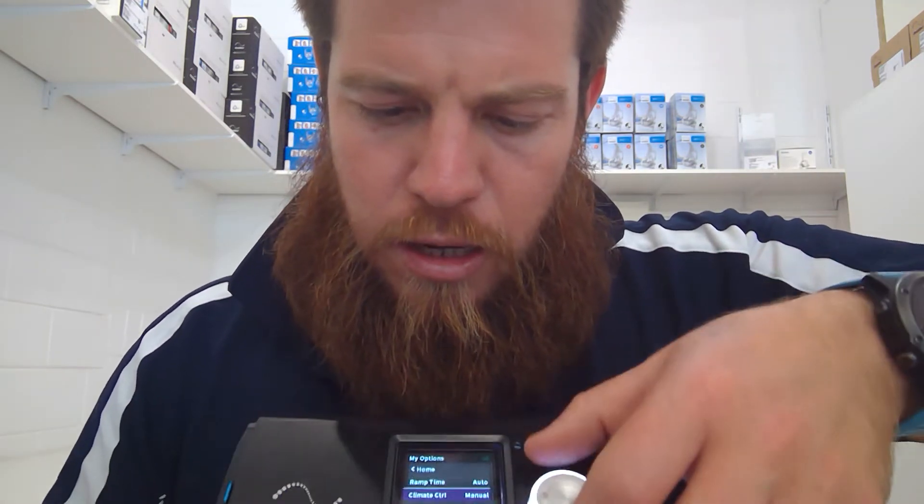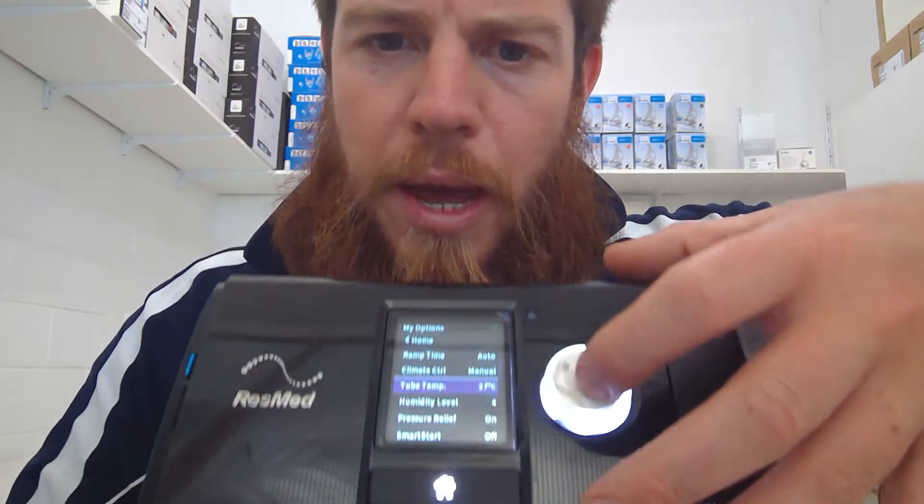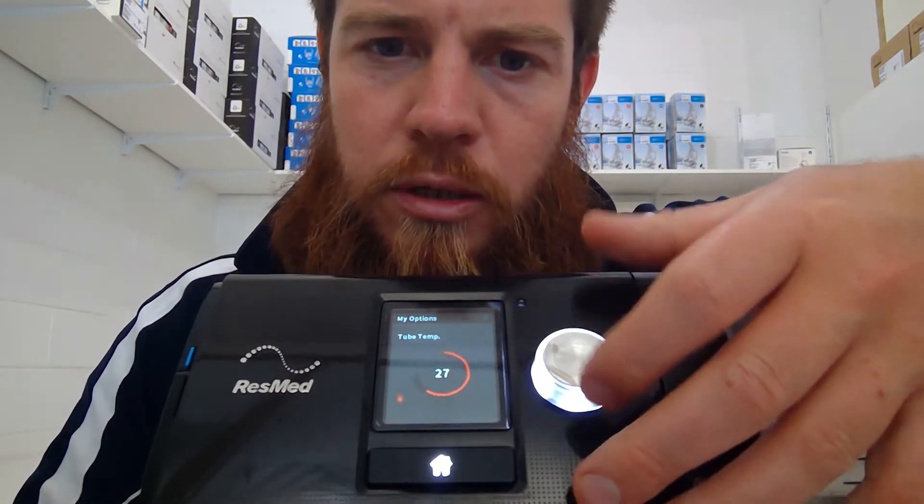Then you can change the tube temperature — it's on 27 at the moment. Coming into summer, you might want the air to be a little bit cooler, so you can turn that down. Just experiment with what you want to do. 27 is the default level, but for argument's sake let's start on 24. If you find it's too warm or too cold, just adjust it accordingly.